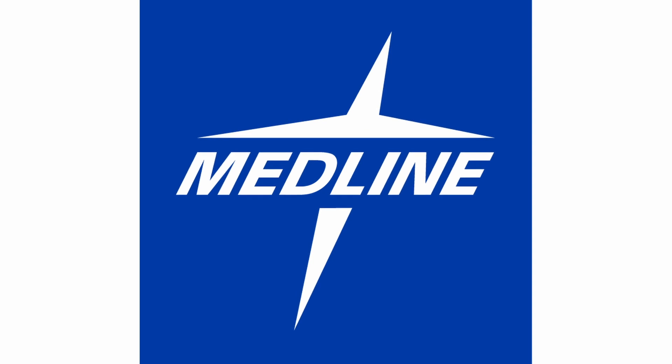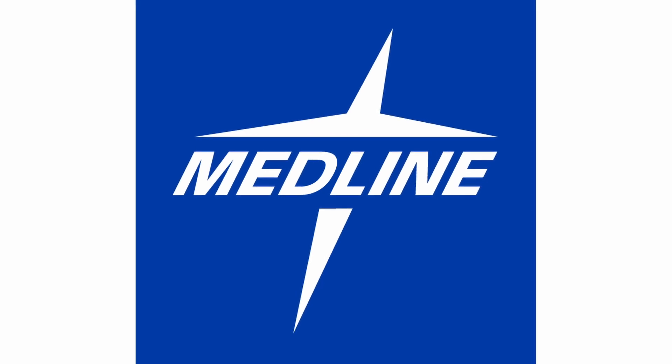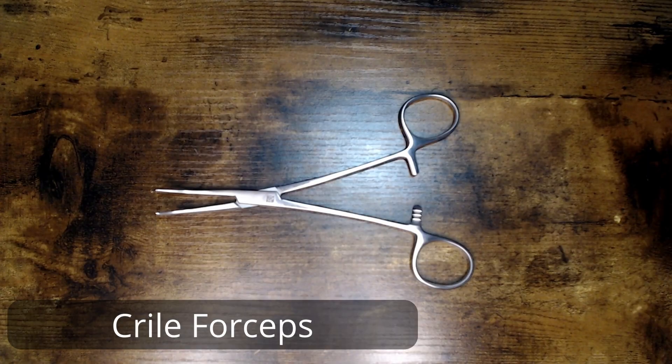The instruments featured in this Hello My Name Is video series are brought to you by Medline, Koenig, and First. Hello, my name is Kryal Forcep, also known as a Kryal Hemostat.